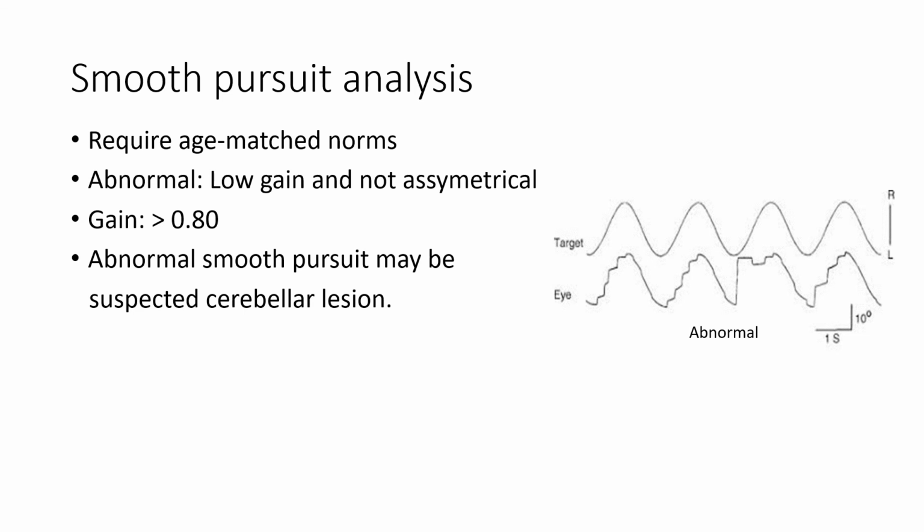There are studies showing smooth pursuit response can be influenced by age factors, because it most likely results from age-related neurodegeneration in specific visual motor pathways. Therefore, it is recommended to obtain your own 5th percentile lower limit norms for each clinical setting.